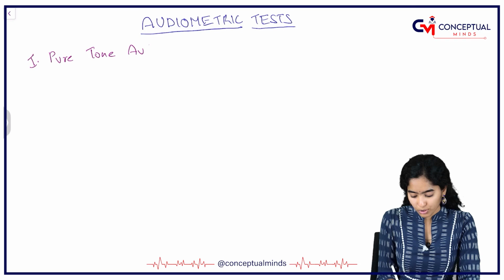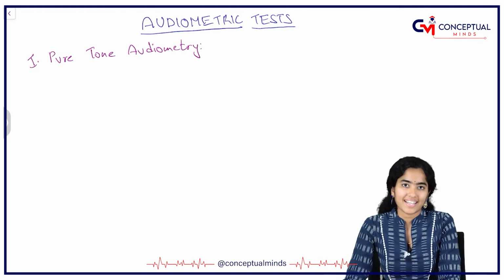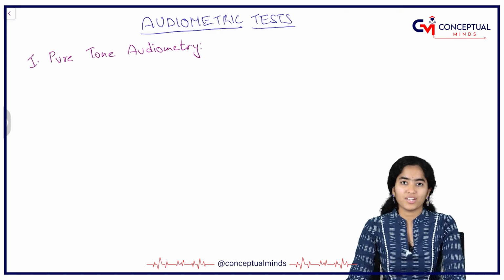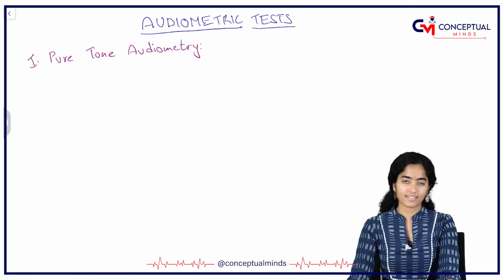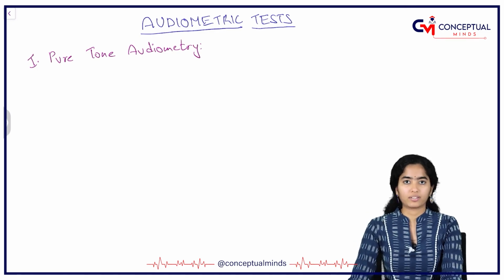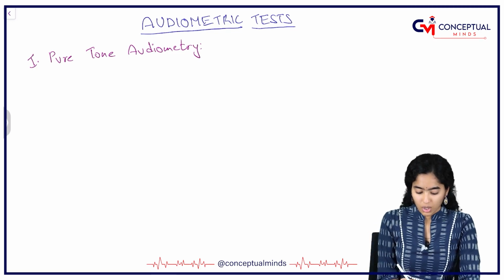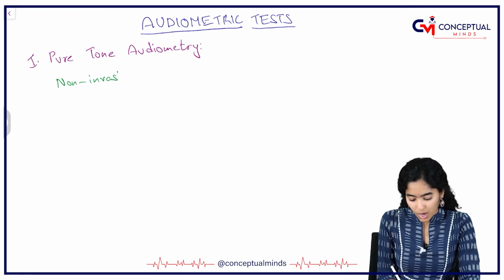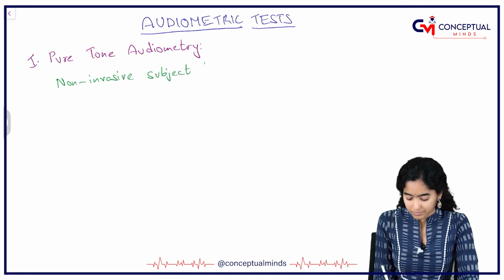So, pure tone audiometry is a non-invasive subjective test. Subjective in the sense you need the patient to respond to you and cooperate. And the results are based on the subject who takes the tests, based on the patient. It is a non-invasive and subjective test. So, what exactly is pure tone audiometry?